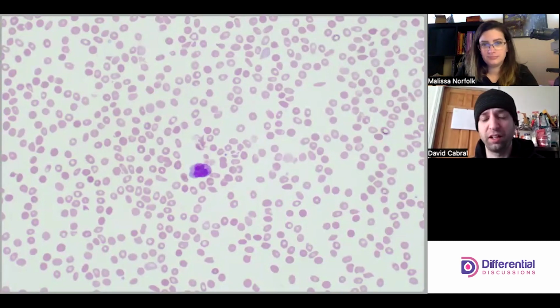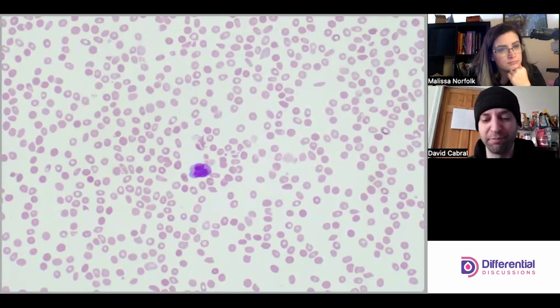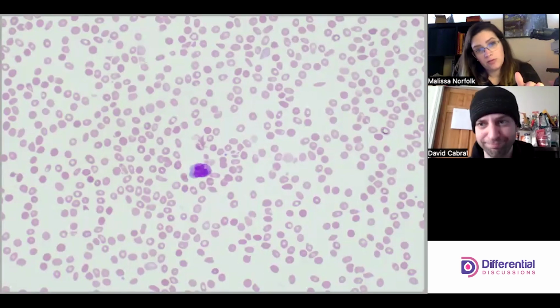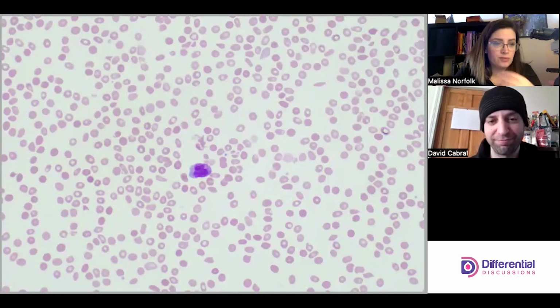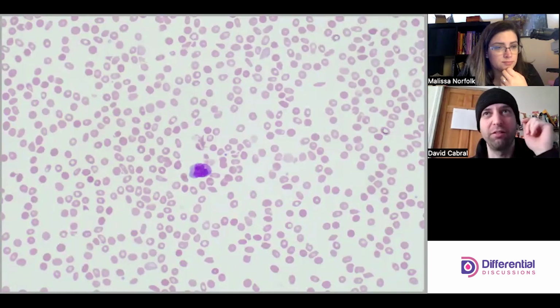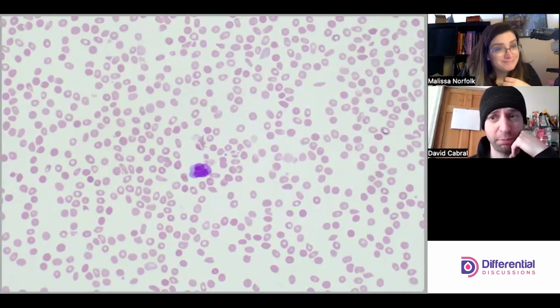I think one of the other clinical features help out, so the anemia and the thrombocytopenia should make you think and worry about malignancies. But it might be difficult to nail down what's going on. Morphologically, it'll be challenging to know if it's an APL microgranular variant or some kind of monocytic type of leukemia. Agreed. That's a challenge clinically because APL can be so dangerous at presentation.